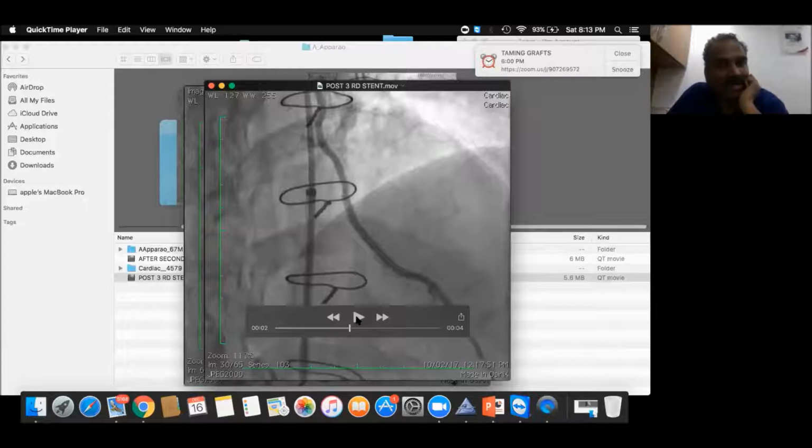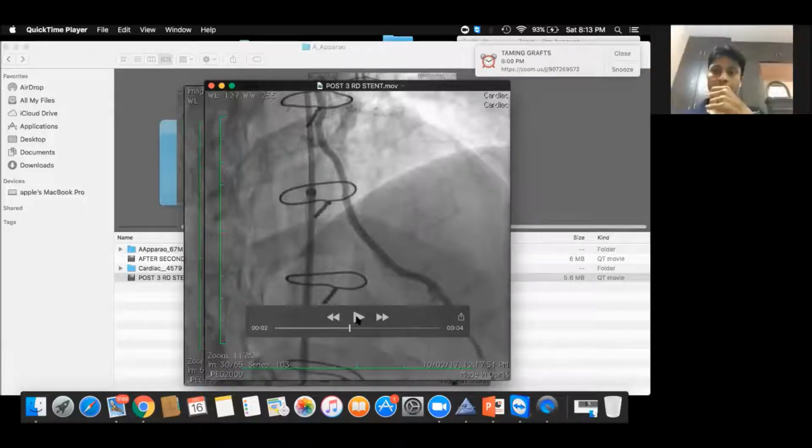But in Lima, there is a good amount of loop left. So that causes multiple loops most often. If the length is not chosen properly, your looping will be more. Loops are because of extra length of the Lima, which is during surgery.